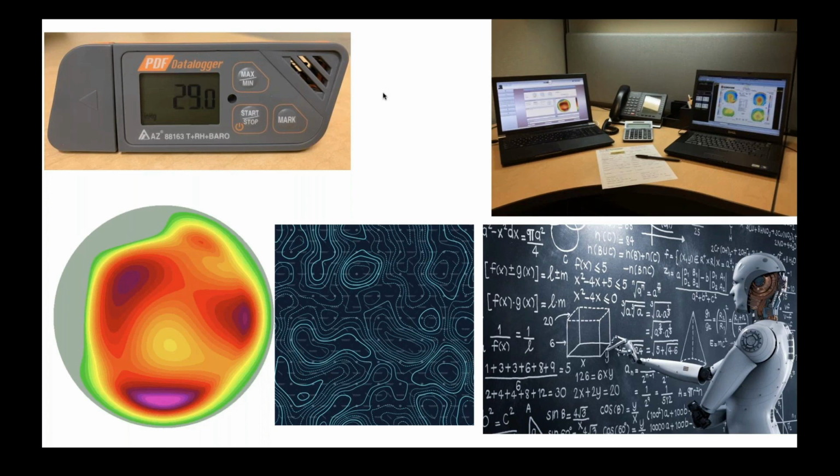A clinic that's in Denver, that's at 6,000 feet, has a different atmospheric pressure than one in Louisiana at sea level. And so how does that atmospheric pressure differ? How does it modify changes in your nomogram? We're going to know this. We're going to be able to have that specific for you and your center.